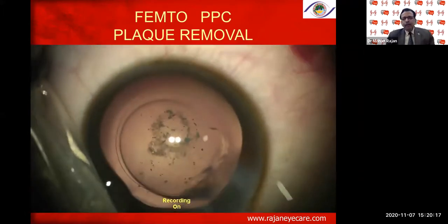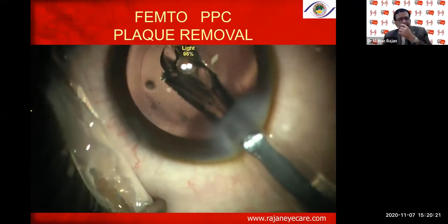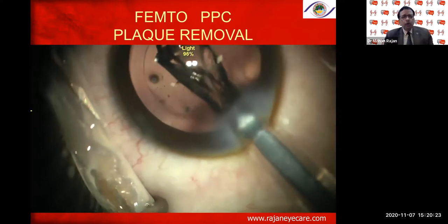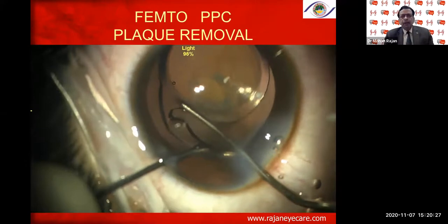And then I went ahead and put a Symfony lens in the bag without any problem. So many of these plaques can be easily removed. If the plaques are not very, very thick, you can probably leave them alone, and probably YAG them later.